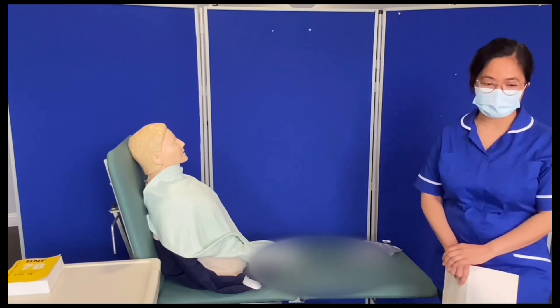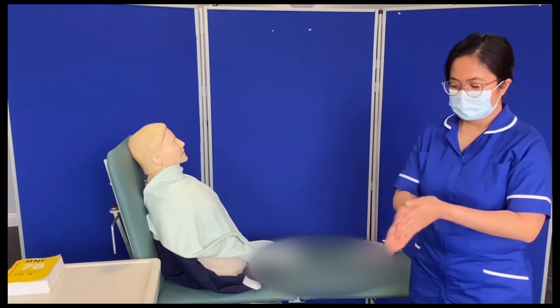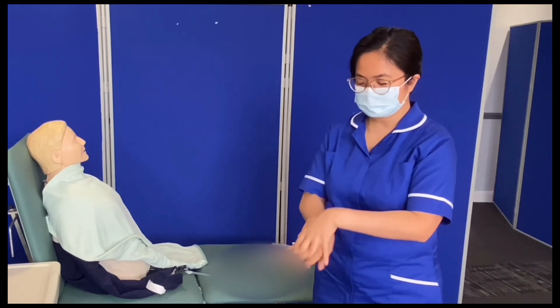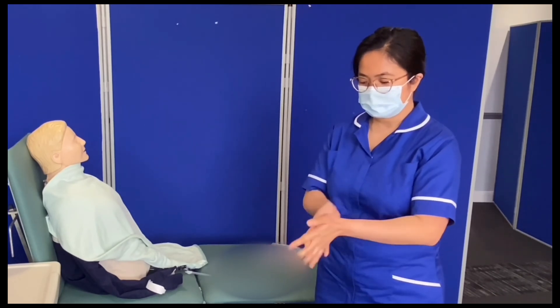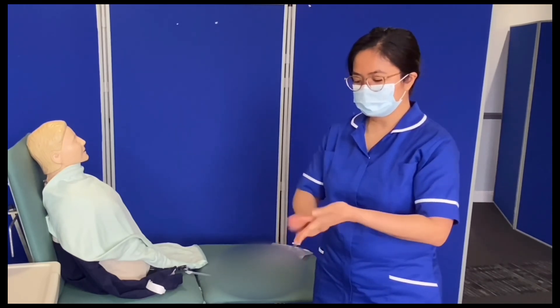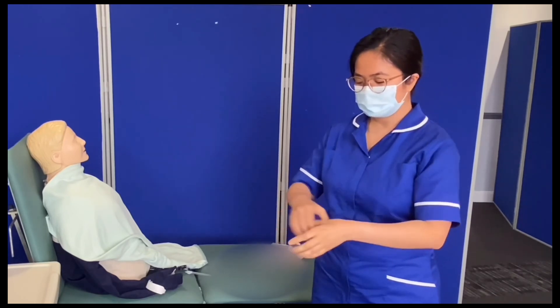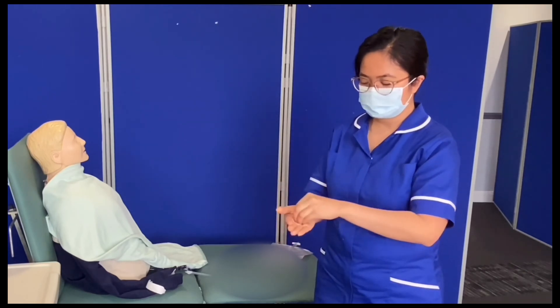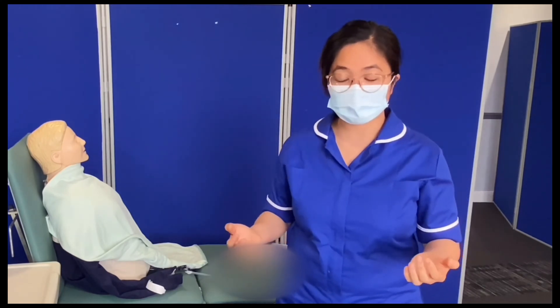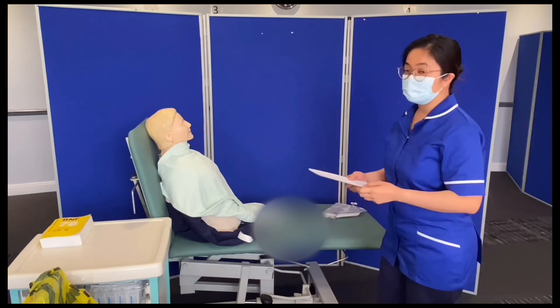For approaching the patient, you have to do your hand hygiene — clean your hands using the WHO seven steps of hand hygiene: back of the hands, fingers interlaced, fingers interlock, rotational movement of the thumb, and fingertips. Then make sure your hands are dry for 30 seconds. Now you can safely approach your patient.